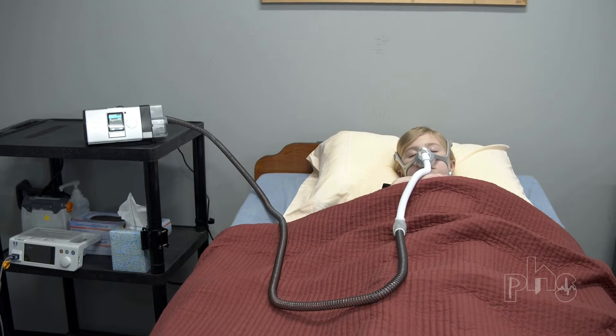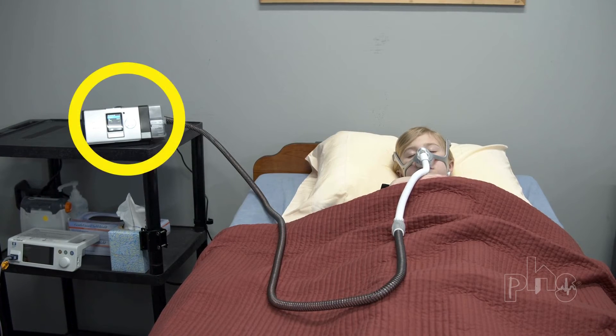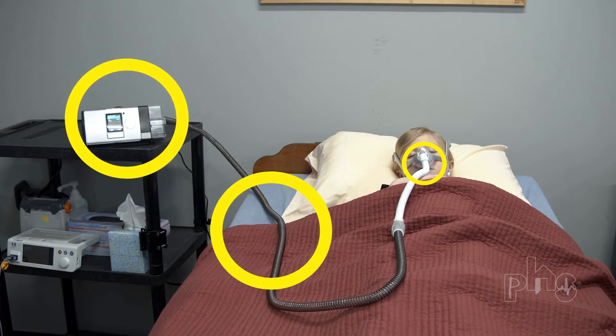CPAP and BiPAP systems provide positive airway pressure to patients through machines, tubing, and masks. Let's look closer at how this system works and the parts needed.